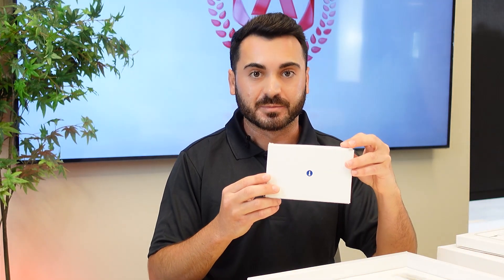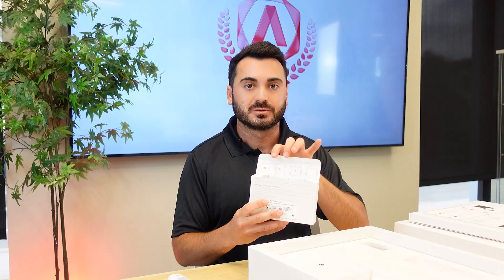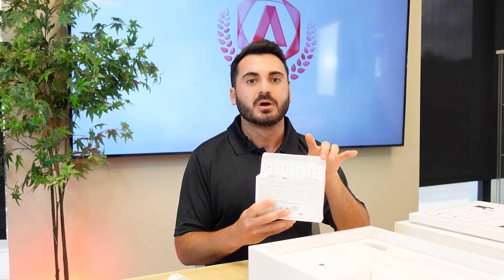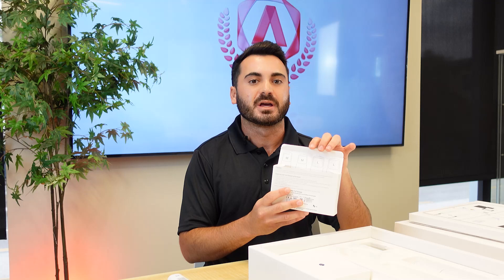Next, we have our package of intraoral scanning tips. Within this package, you're going to have four total tips — two medium and two larges. With the larger size, you are now getting a bigger scan head and thus a larger field of view during the scanning process.